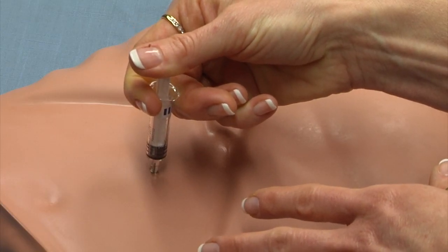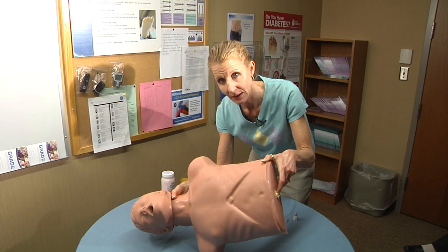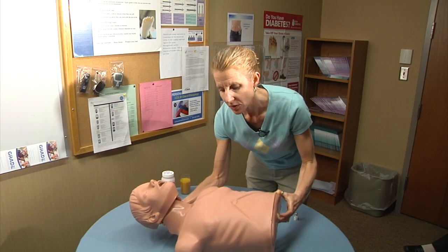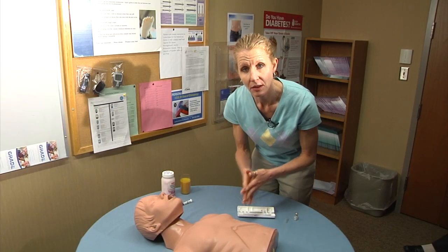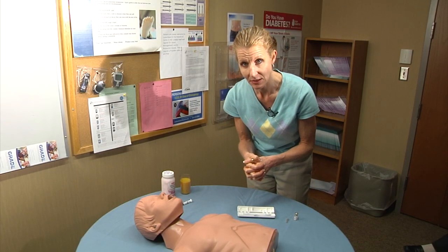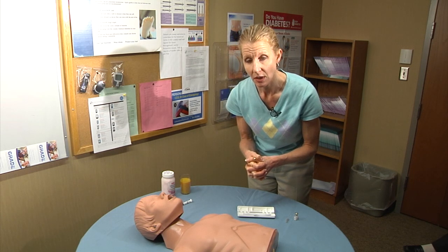Meanwhile, you want to make sure that the person is placed on their side, because glucagon can sometimes cause nausea and vomiting. The patient should respond and become alert and awake within less than 15 minutes. If they do not respond, you want to call 9-1-1.